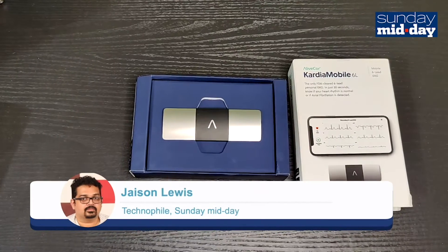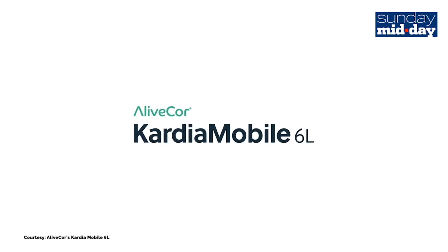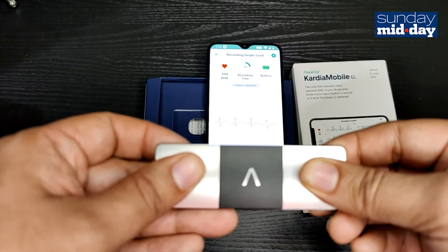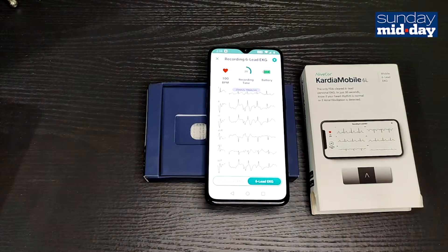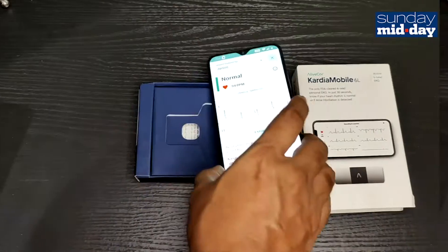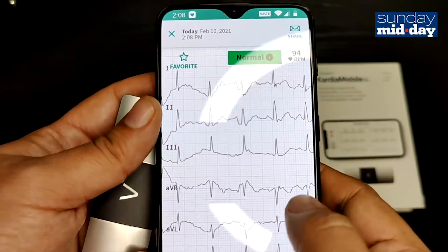Hi, this is Jason Lewis, Midday's Technophile. The AliveCor Kardia Mobile 6L is a personal medical device that can record your EKG in a few seconds. The device can easily tell you if your heart is in normal condition or if atrial fibrillation is detected.